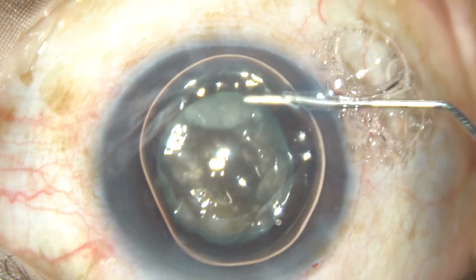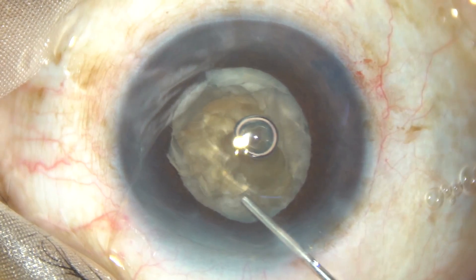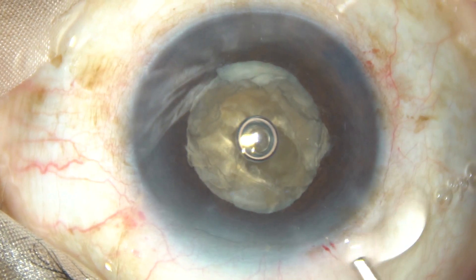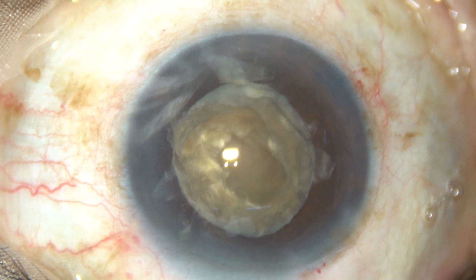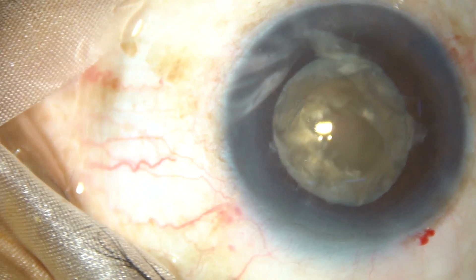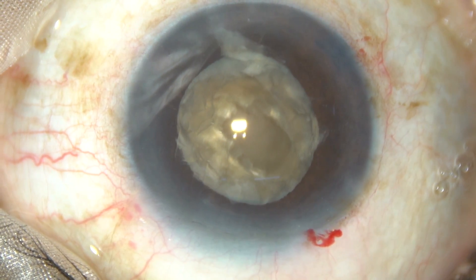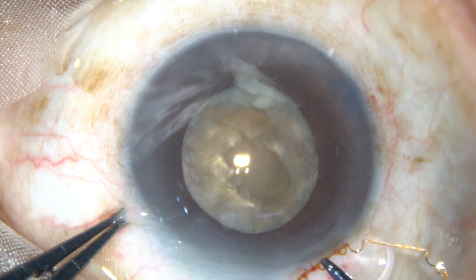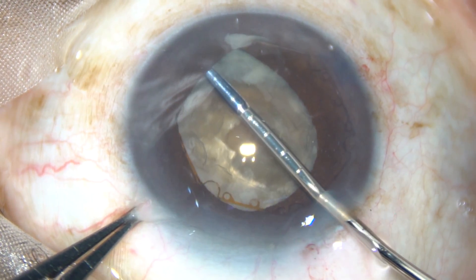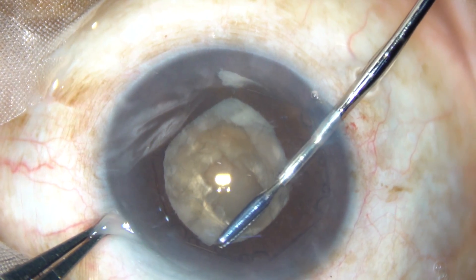At this moment the pupil is very small. I am applying a bit of adrenaline to see if the pupil dilates, but it did not dilate much. So I have planned to apply the pupil expansion device. Since the cataract is hard and the pupil is tending to become small, I dare not take more risk. So here goes the B-Hex pupil expansion device.